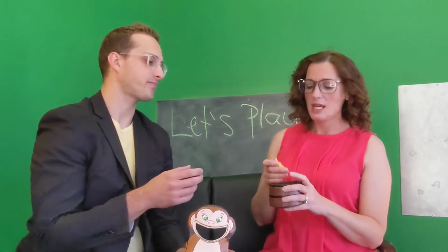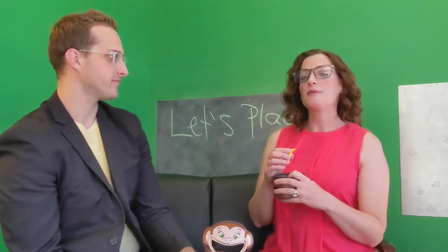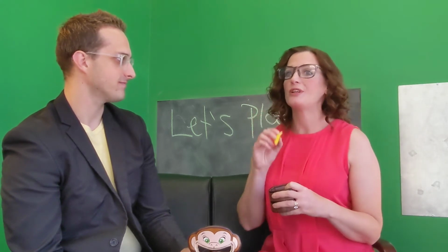I'll be the kid. Okay, so I'm going to say, JJ, we're going to play a game. We're going to listen to little birdie sounds. Every time you hear a sound like this, wah, wah, wah, wah, wah, you get to feed the monkey.